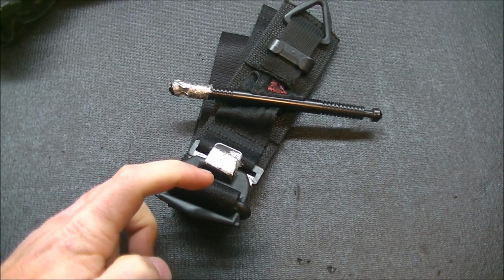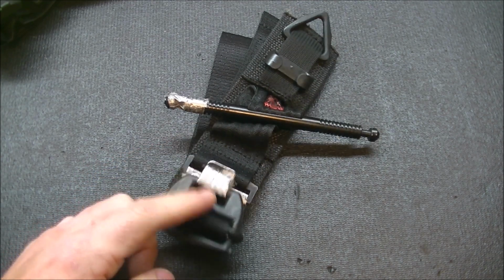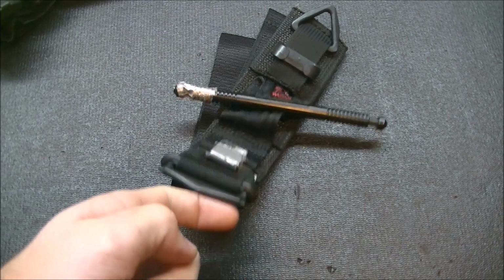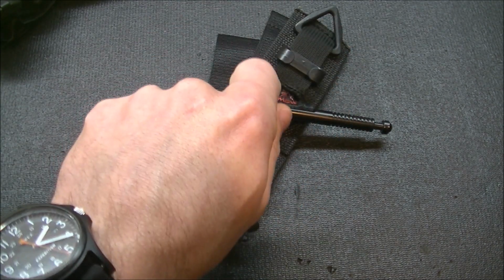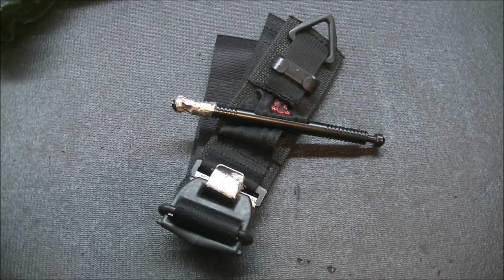Like when I practice self-application of tourniquets, especially the SOFTT-W, I have issues getting this off because of this piece right here. Because I start with this piece and then I loosen it up if the windlass is giving me issues, because every now and then it will.